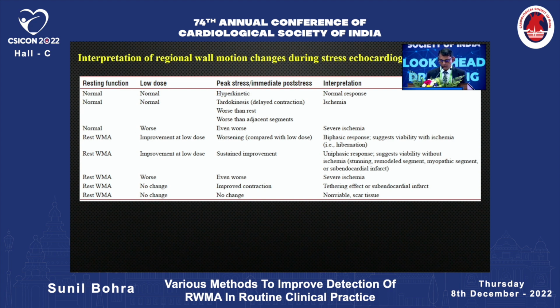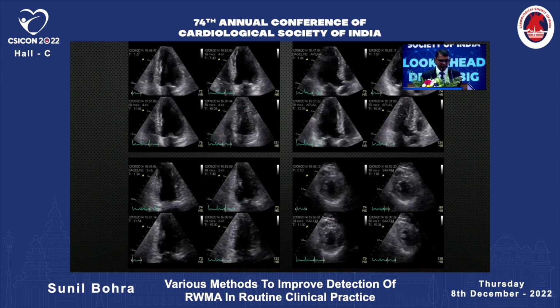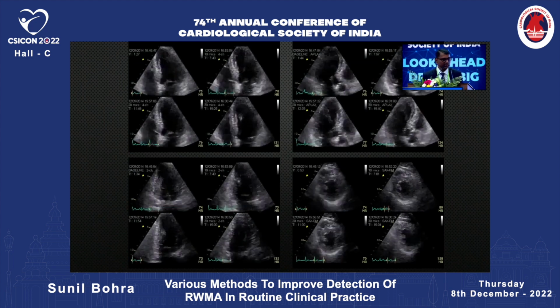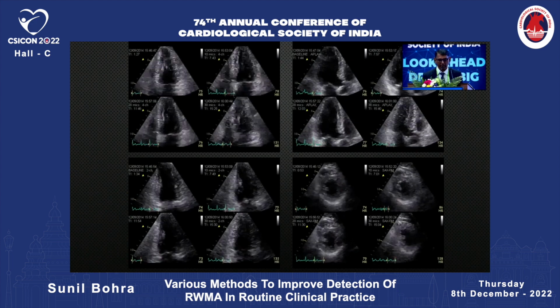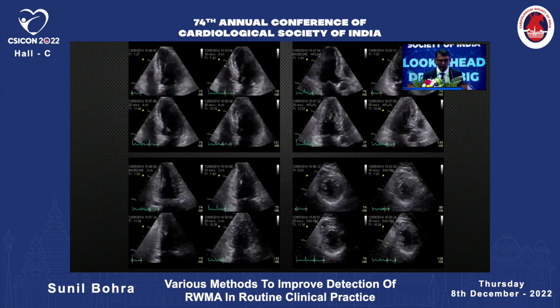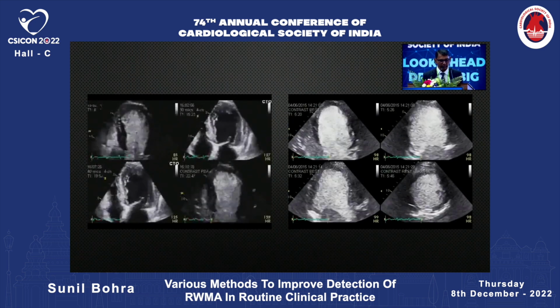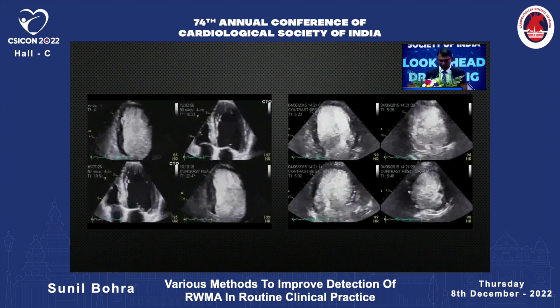stress echocardiographic analysis. So this is one of the examples wherein the quad screen format is used, and we compare the various views, the 4-chamber, the 3-chamber, 2-chamber, and then the short axis, and then we can go step by step and analyze and give our interpretation of the wall motion. And contrast study during dobutamine is recommended, and it gives us a very high incremental value in reporting.